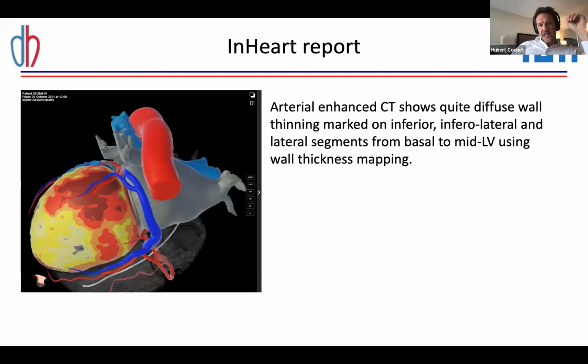It's rare. When you see that, the dark red here is 1 millimeter thick. So usually in DCM, you have a diffuse thinning that is mild to moderate, but it never goes down to 1 millimeter. When it does, it's usually suggestive of post-inflammatory scar, I would say. So it's probably an old chronic remodeled myocarditis, and then it behaves a bit like an old infarction. There are clearly areas of total block around which arrhythmia can perpetuate.